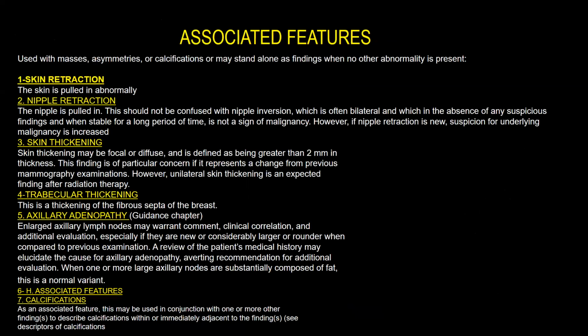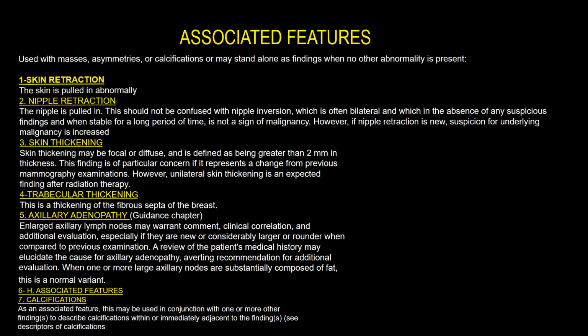So as you know, the associated feature is either skin retraction or thickening, skin changes, or nipple changes, nipple retraction. Trabecular thickening, skin thickening, as we mentioned, axillary adenopathy, or calcification, or architectural distortion can sometimes be considered as an associated feature.